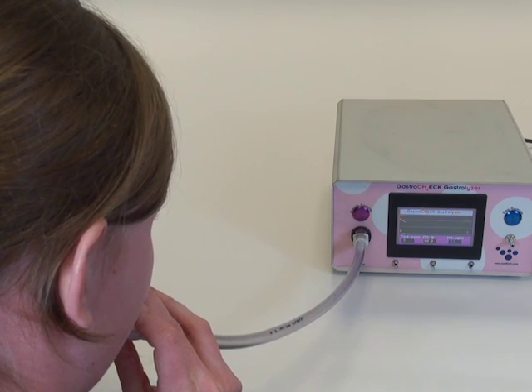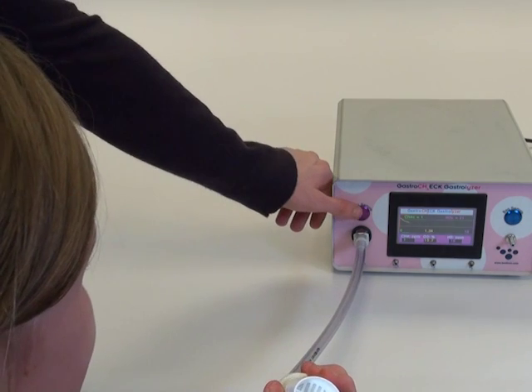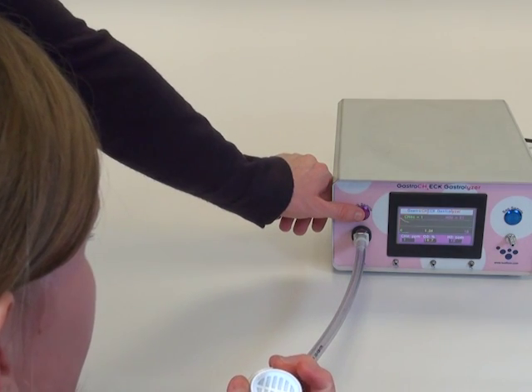After the results have been recorded, press the breath test button to go into standby mode, ready for the next test.